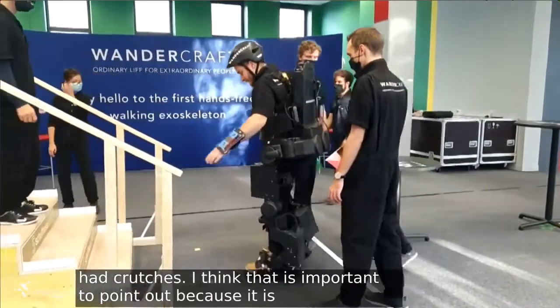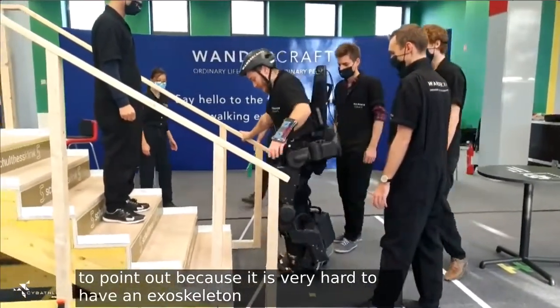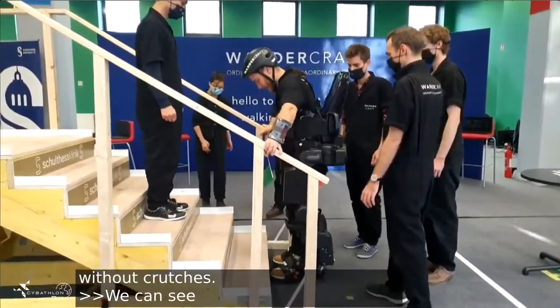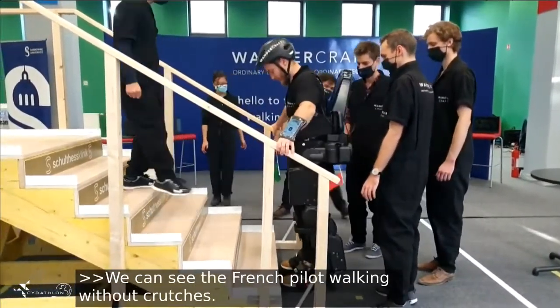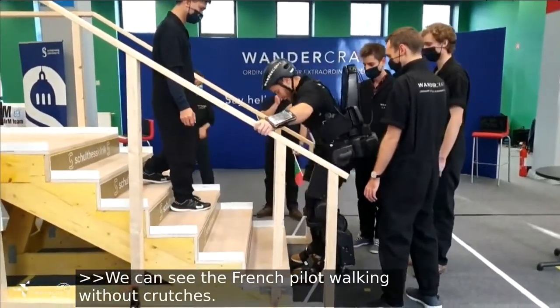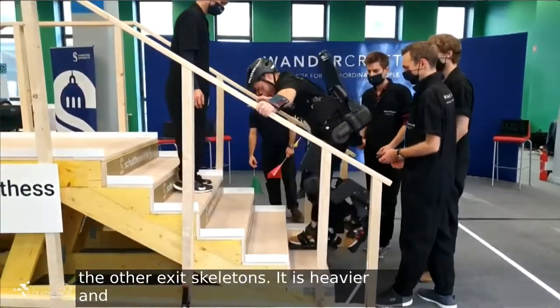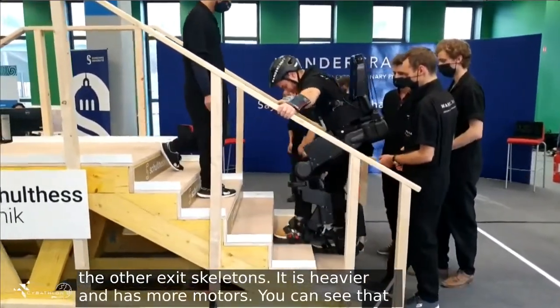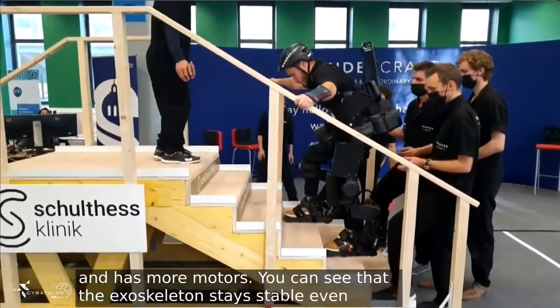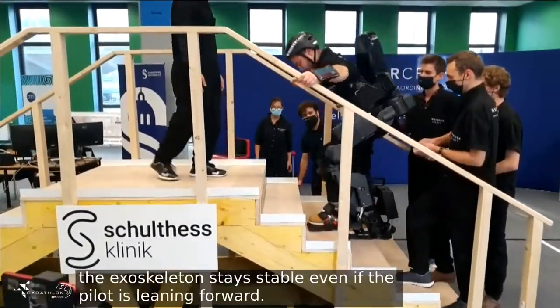We can see him walking without crutches — the French pilot. Can you tell us more? How does it work? So this device is a bit more complicated than the other ones — it has more motors, it's a bit heavier as well. And you can see that even though the pilot is leaning forward, the device remains stable. The whole device is designed so that even if you move your upper body too far forward, it remains stable and doesn't tilt forward.